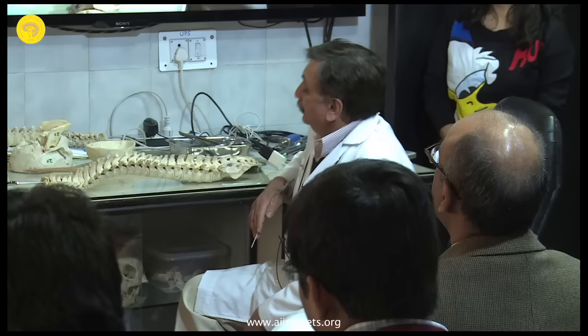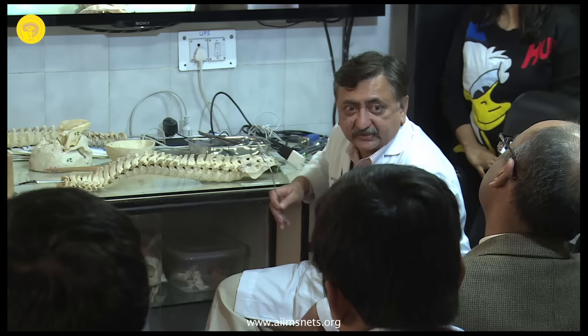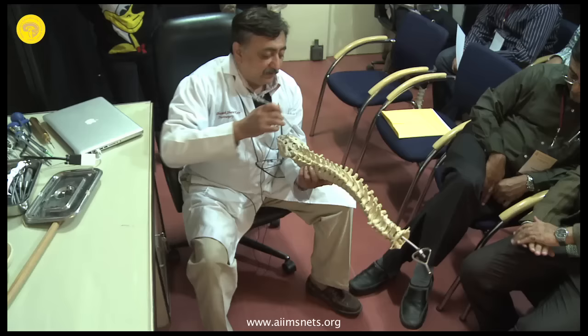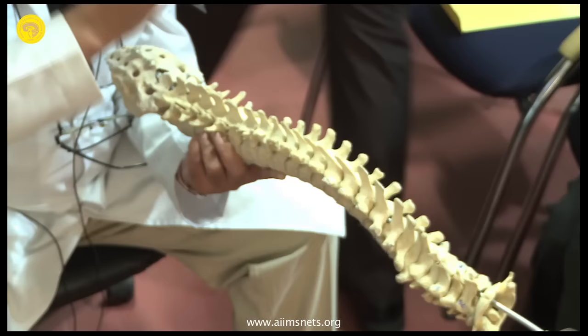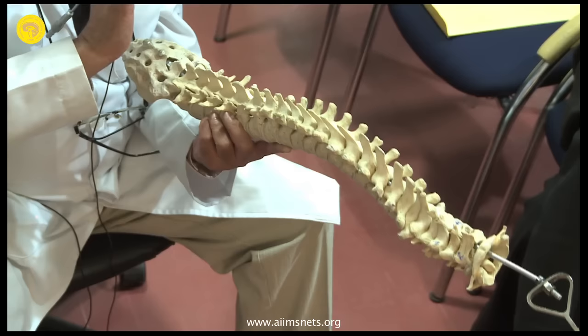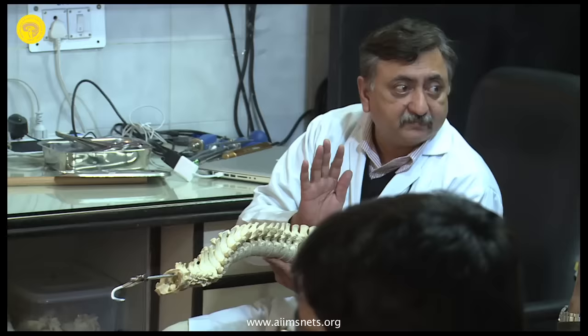Okay, so the common method of fixation used in spine surgery is pedicle screw fixation. This is one of the basic techniques, so you must know about it. Pedicle screw fixation was established because you can engage all three columns, the posterior, the middle and the anterior column, by this one method of putting a pedicle screw in the body. So you cover all three columns, so it gives you the maximum stability.